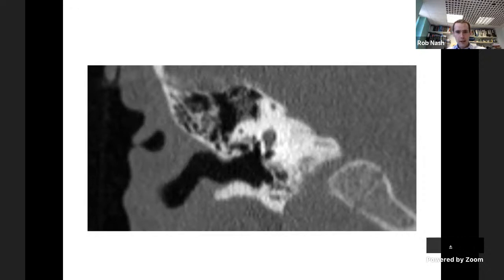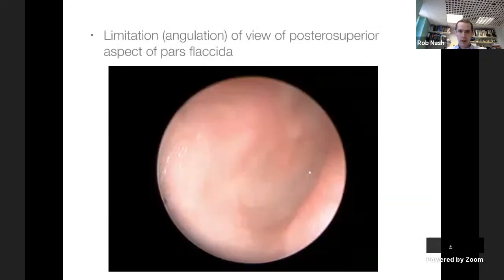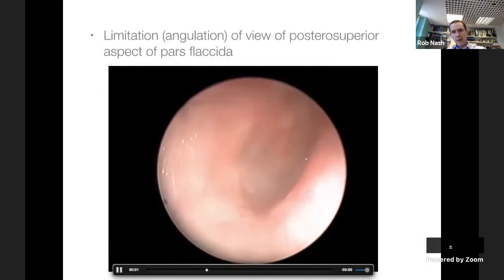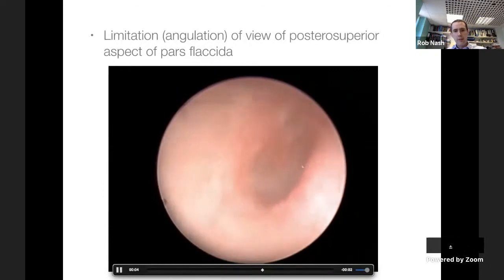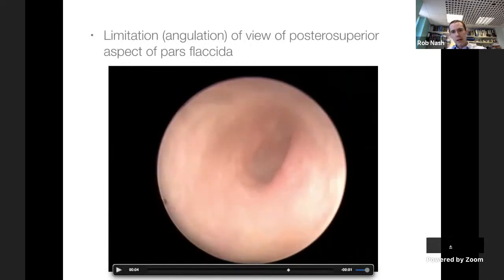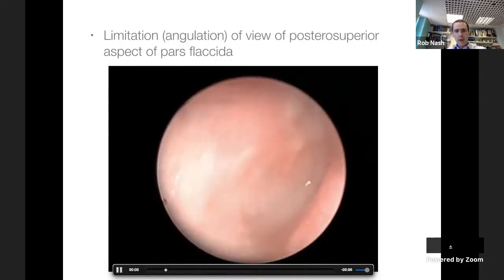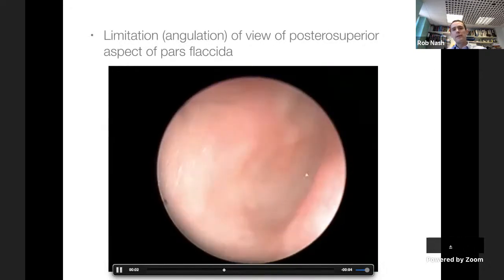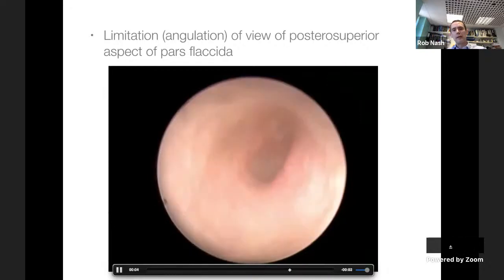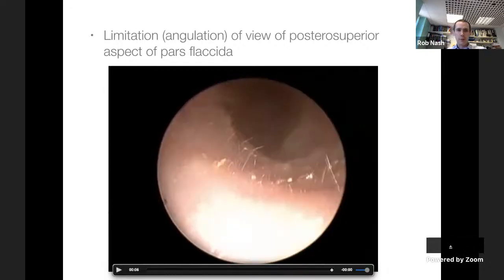Adults with a normal eardrum and conductive hearing loss are most likely to have otosclerosis. Children with an intact eardrum showing some inflammation, a conductive hearing loss, and a flat tympanogram are very likely to have glue ear. There are some limitations though - here you can see fluid and squamous debris in the ear canal, and only when you pull back with the endoscope do you see a collection of keratin in the pars flaccida - cholesteatoma.